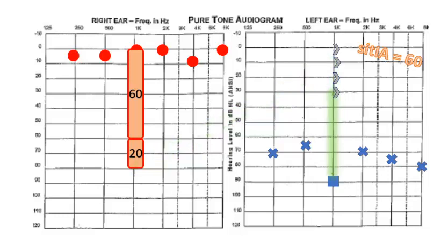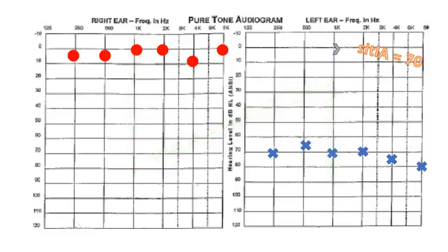30 dB would mean that we would have a possible air-bone gap of 60, so 20 dB of masking noise might cross based on a SIT-IA value of 60. But 20 dB of cross-masking noise wouldn't be heard by such a test ear and therefore wouldn't cause overmasking. Besides, we've already established that our SIT-IA for this case, using insert phones at 1000 Hz, must be at least 70 dB, purely from our unmasked test results.